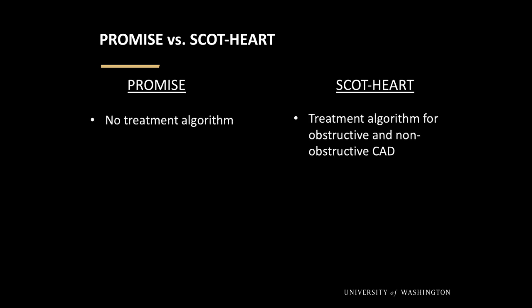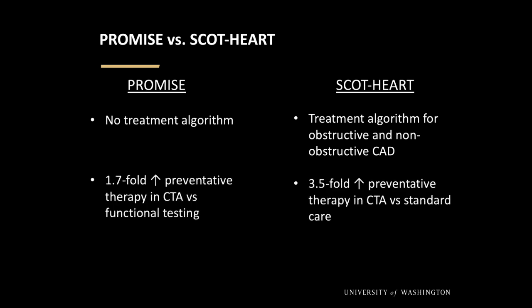So we see again with PROMISE that there was no treatment algorithm for the results of the CTA. And in SCOT-HEART, they instituted a treatment algorithm for obstructive and non-obstructive disease with the CTA. And what did they find? Well, they saw that in both trials there was an increase in preventative therapies.